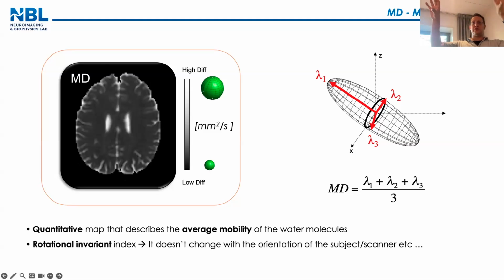When I have these two data, the simplest analysis is to normalize and do a little bit of maths and extract an ADC map. The ADC is the map of diffusivity. The raw data is the DWI and the b0 is another raw data, and the ADC is the map of diffusivity. That is the simplest.